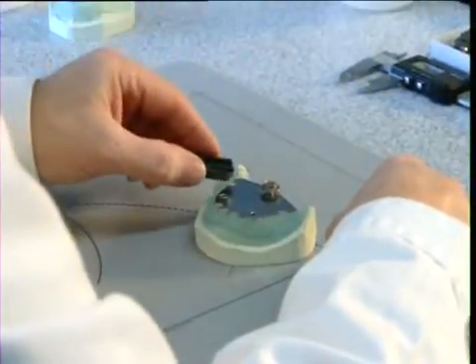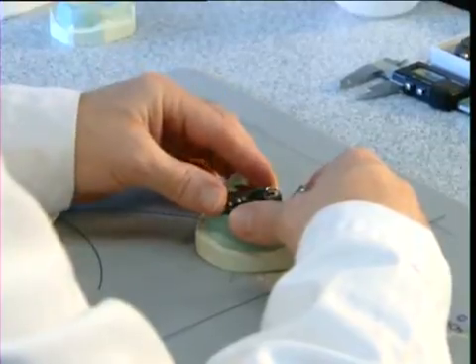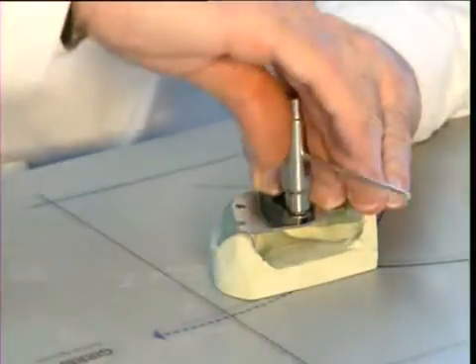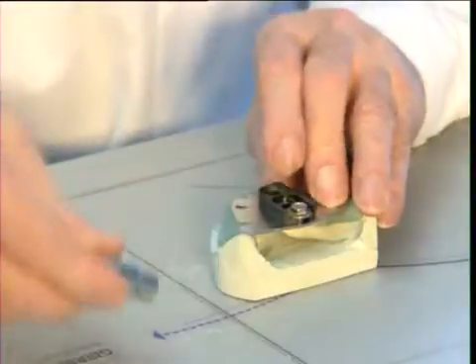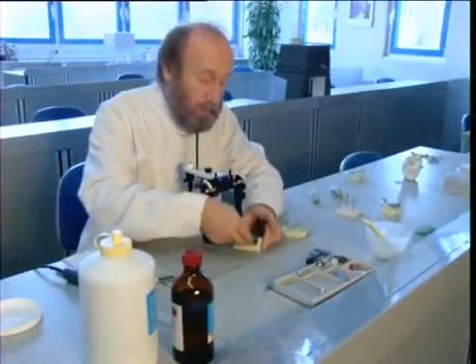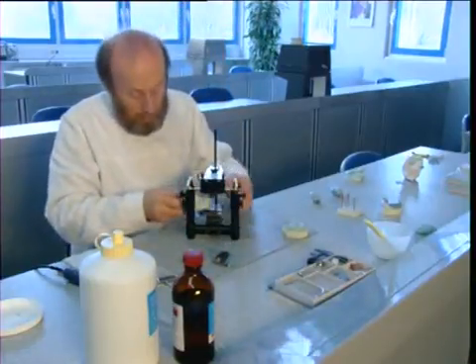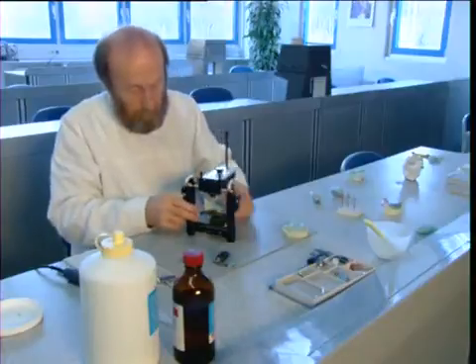The alignment clamp is fixed to the tracing plate with a dorsal hexagonal screw to ensure that the tracing ball holder is positioned in the center and level with the first premolars. Both models are fixed into an Artex fixed grip model holder and placed in the correct intermaxillary relationship using the silicone blocks produced in the surgery.